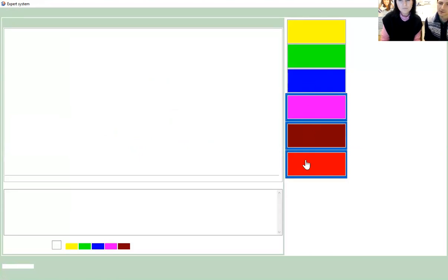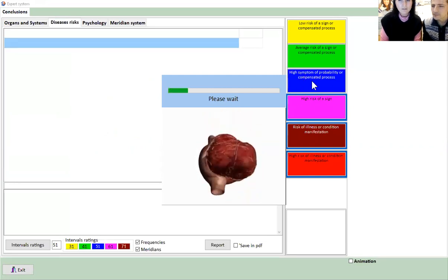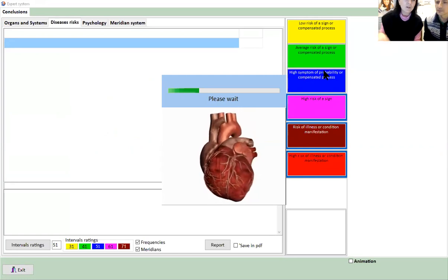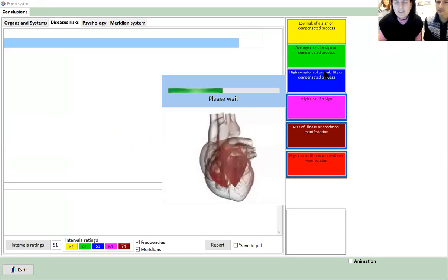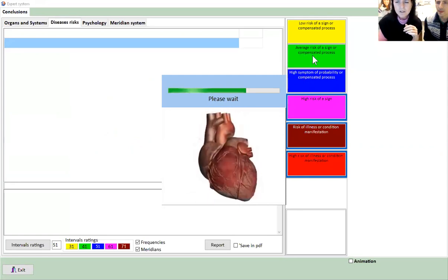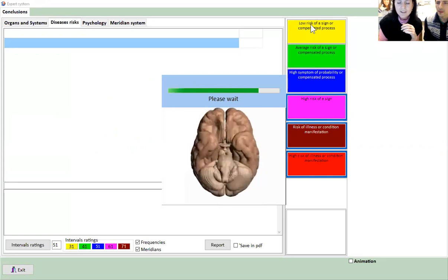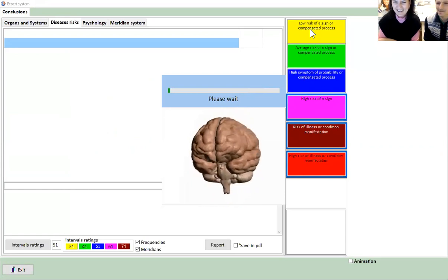So if you see the kidneys show a blue color, they are a little high, a symptom. The same colors come up here too. There is one color, a light blue, which is actually this yellow. It is strange, but you have to know.